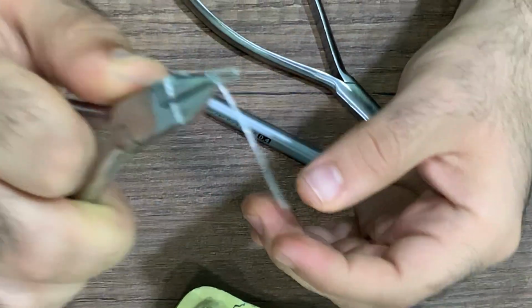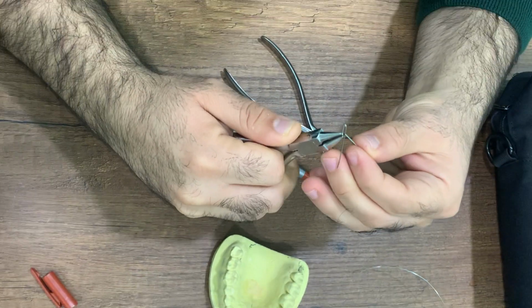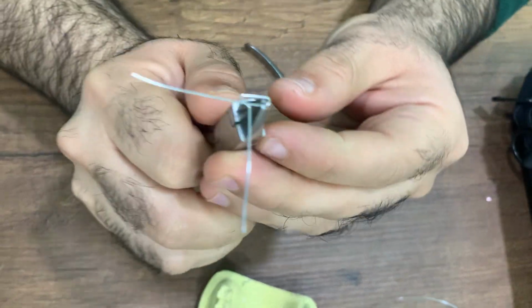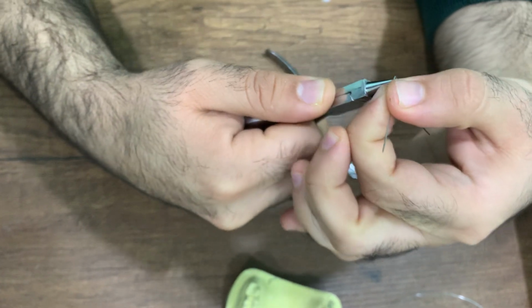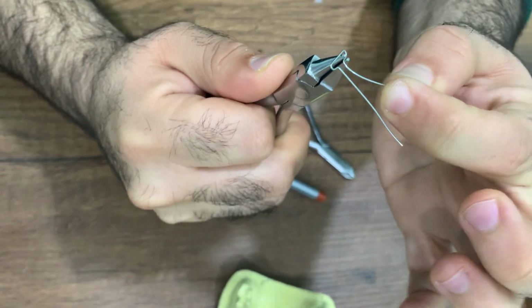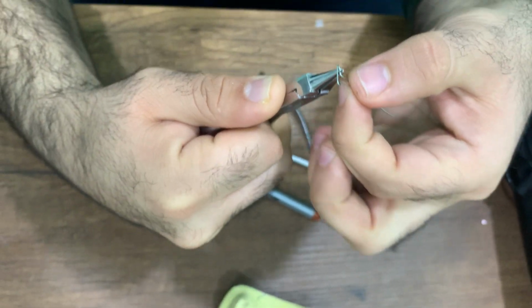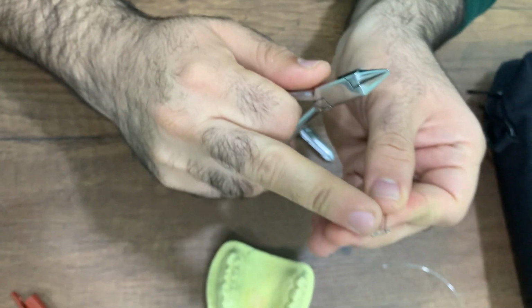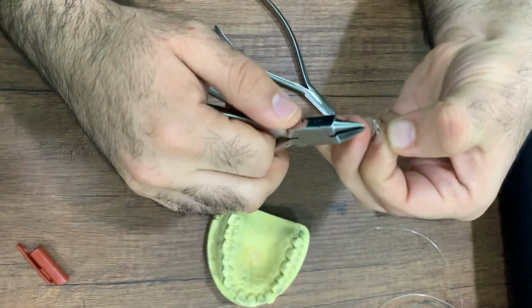At right angle to the U-loops. Again, the second arm also at right angle to the U-loop.